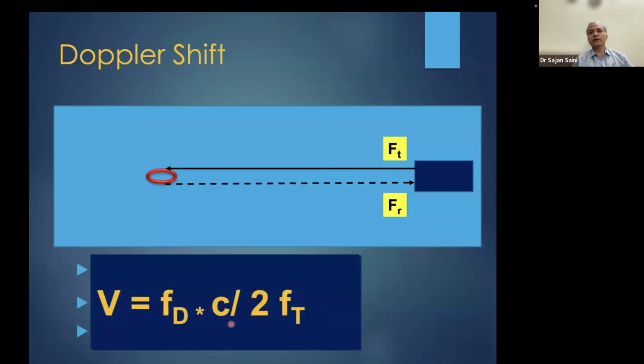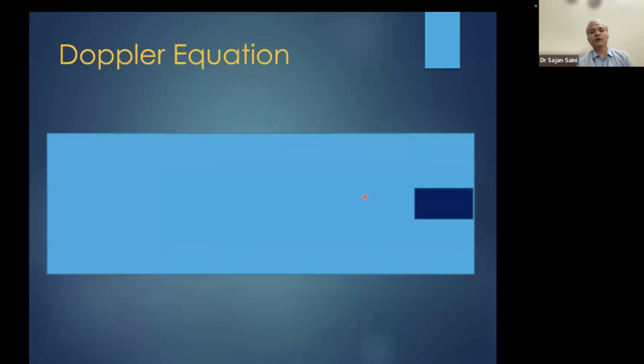So this has application, because if we want to know what the speed of the blood is, we can know the speed of the blood by applying these principles of Doppler shift. Okay. Now there is one more issue associated once this object is moving inside the body. In the previous example, the blood was moving towards the object, but it is possible the blood is moving at a slight angle to this ultrasound beam.